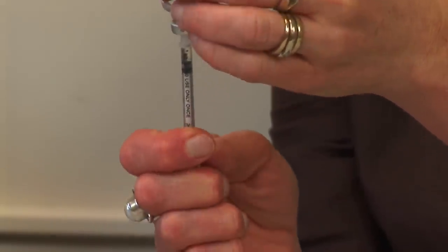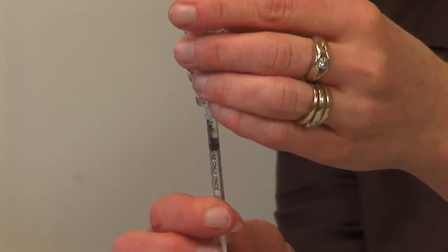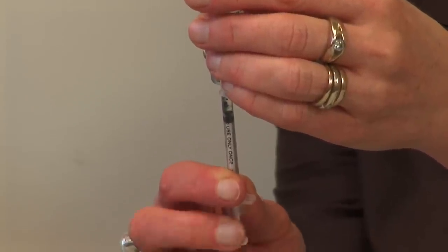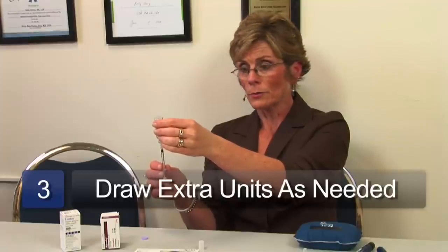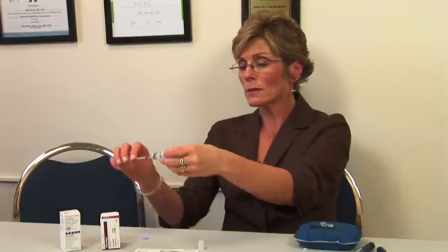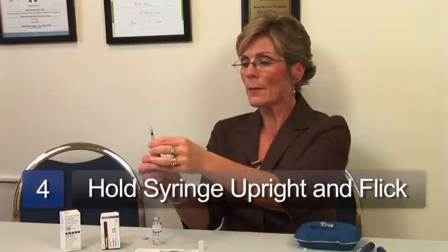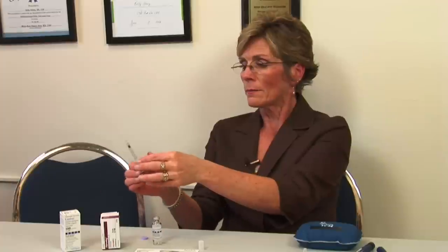If I don't get all the air out, I can try pushing the plunger two or three times. If we still can't get the air out, what we'll do is have people draw out an extra unit or two — so if I need five, I'll draw out six units of insulin, hold it upright, flick it to get the air to the top, and then push it out. The air isn't going to cause any lethal problems like the movies show, but if we don't have all the air out, we're not getting the full dose of insulin we need.